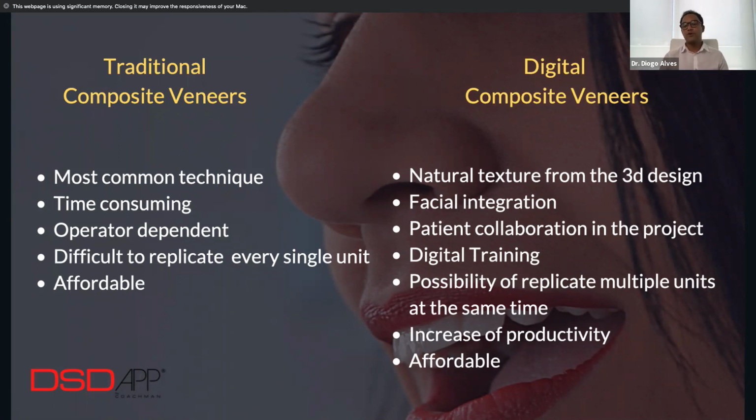However, I want to give you a new approach, which involves the patient experience, digital workflow, natural texture using the 3D, facial integration, and patient collaboration. Here on your screen, on the left side, we have the traditional composite veneers. It is the most common technique.